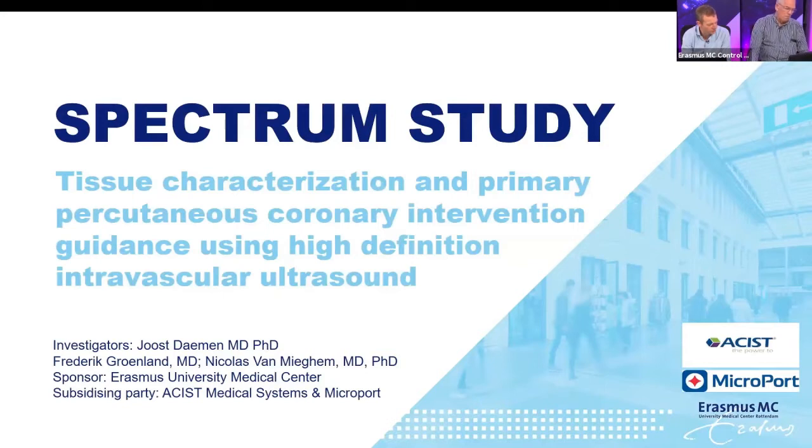So this is one of the studies we're currently performing here in the Erasmus Medical Center, a prospective observational study aiming to enroll 200 patients that will undergo IVUS guided stenting with the Kodama system, in order to assess how the IVUS will affect our treatment strategy in these patients as one of the key endpoints.